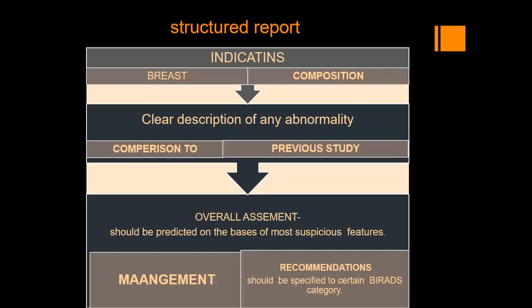And just to remind you, the structured report should include indications, breast composition, and a clear description of the abnormality. We have to compare with the previous, and then give an overall assessment category, which should be predicted on the basis of the most suspicious features. Accordingly, we will give management recommendations, specified to certain BI-RADS categories.